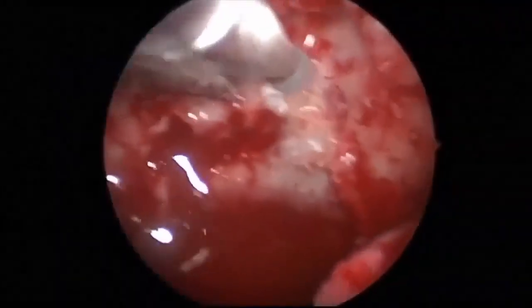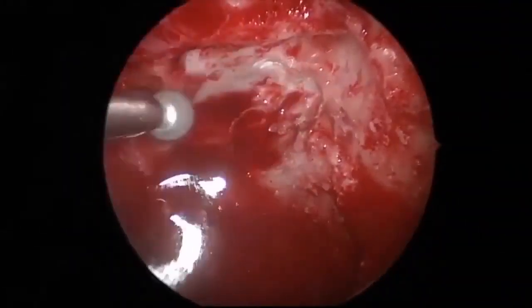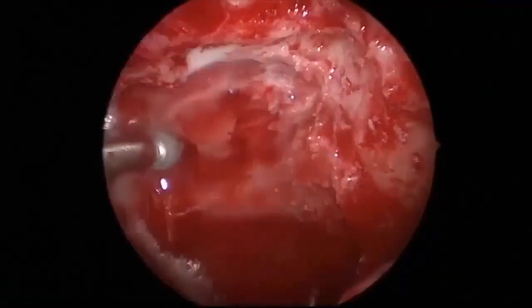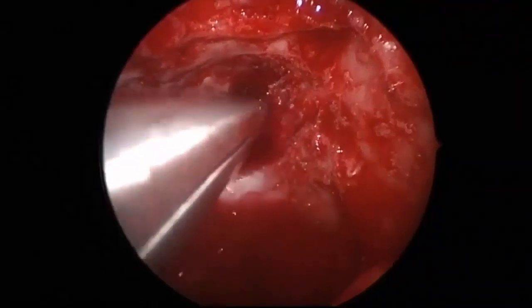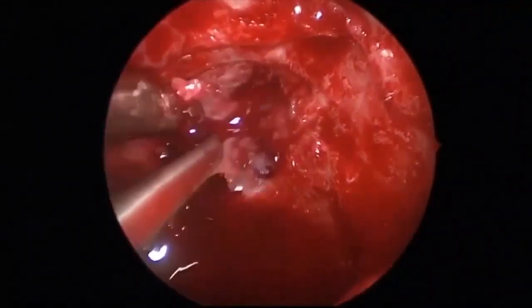As you recall, the tumor extended anteriorly approximately halfway along the planum, therefore the bone must be drilled down all the way to expose the complete base of the tumor in order to achieve a gross total resection with a Simpson grade 1. The tuberculum is removed with a Kerrison.